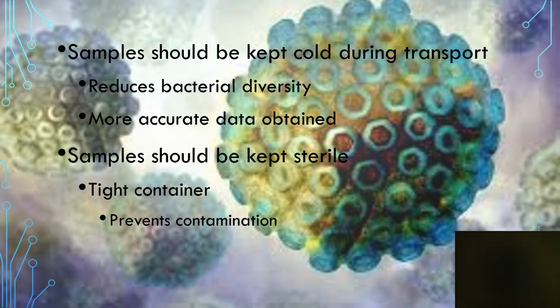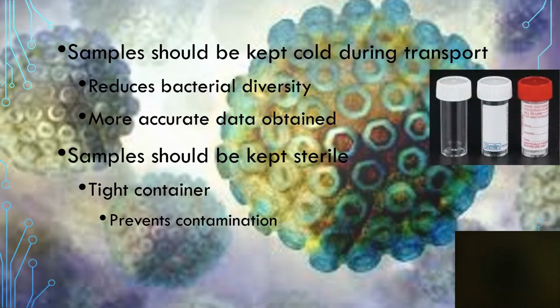At cool temperatures, more accurate data can be obtained or tested when arriving at the lab. Precautions such as having a rigid container to protect the samples during transport is also a must to prevent breakage and maintain temperatures, especially when using a courier to deliver the package to the lab. Keeping the culture sterile and tightly closed is important to allow no organisms or bacteria inside and maintain somewhat of a pure culture to avoid contamination.